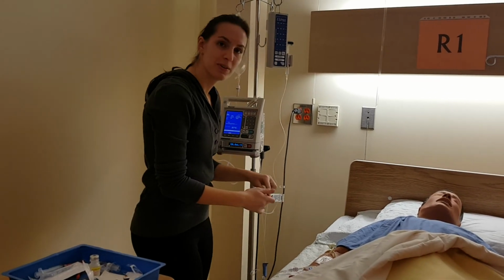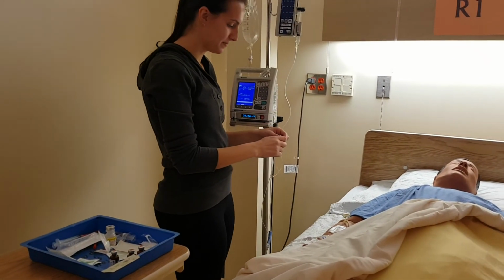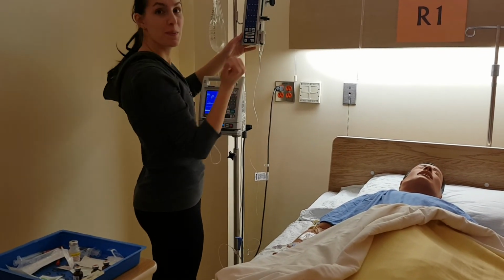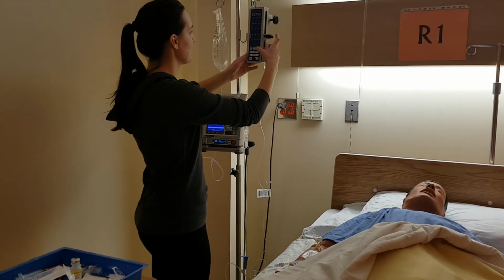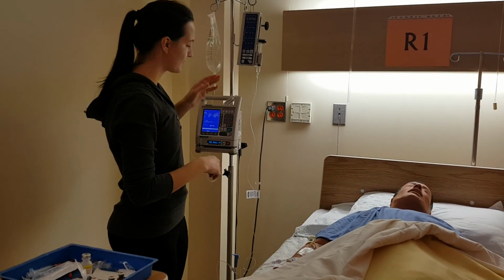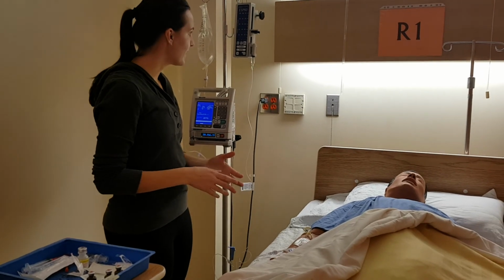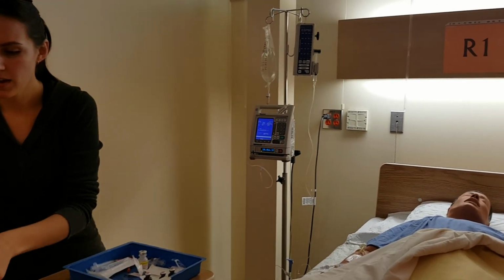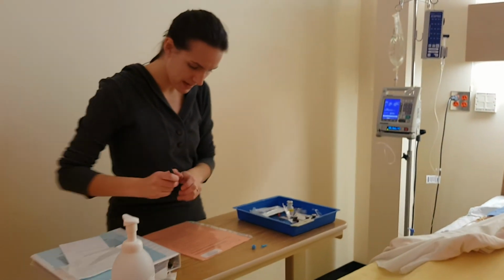At this point, I will ensure that my clamp is open, and I will start normal because it's supposed to be on the normal setting. Looks good. Okay, this is right then. So my medication's running. I'm going to continue to monitor my patient. I would document on the MAR that I've given the medication.